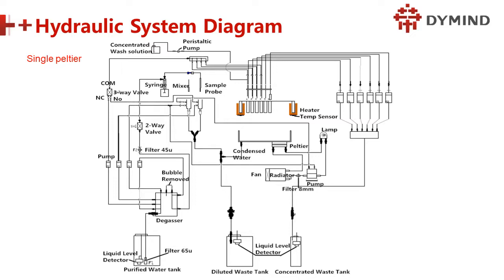Sample probe, right? So you can see this one is moving. This is the place. If I need a blood sample, the sample probe will go to here and feed the blood or the sample, feed the reagent, right? So where is the power? Who is pushing the reagent or sample into the cuvette? This is a syringe, right? The syringe is moving up and down.